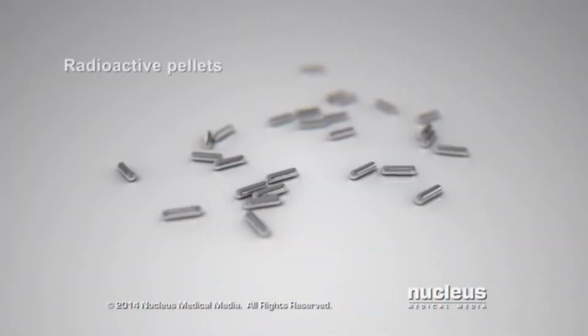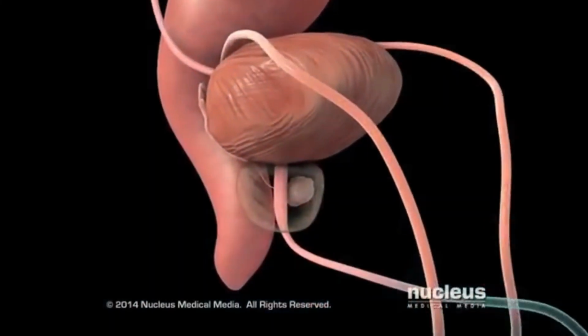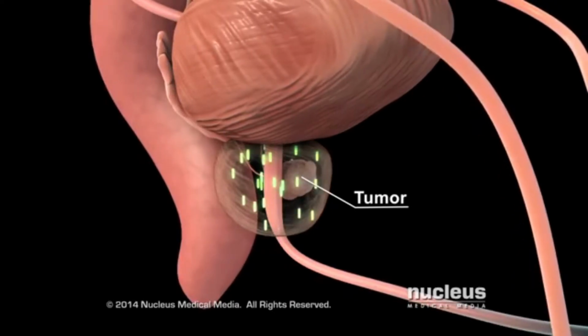So, what is brachytherapy? The brachytherapy method is done simply by placing the radioactive source close to the cells that we want to treat. This means that a stainless steel needle-like structure, which is called a probe, will penetrate towards the cancer cells.